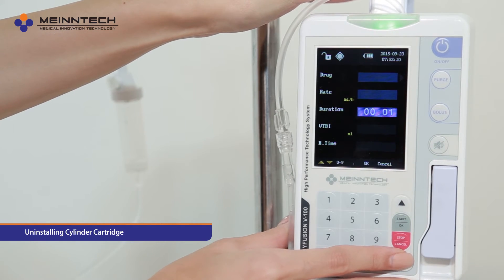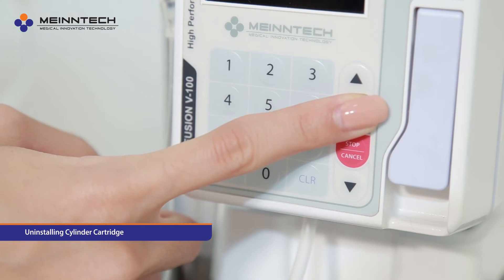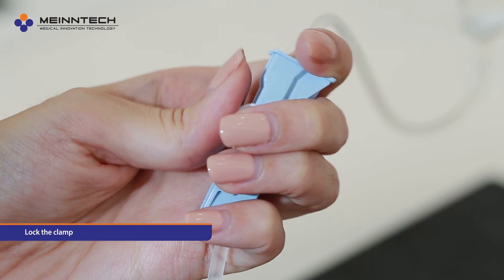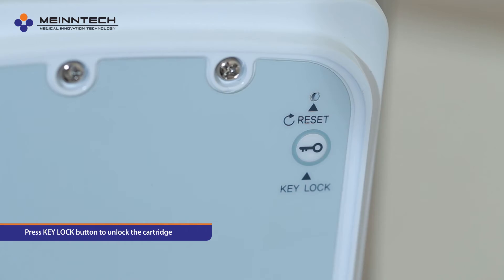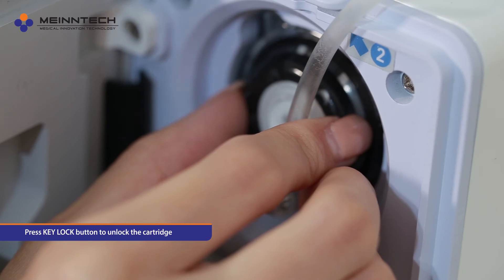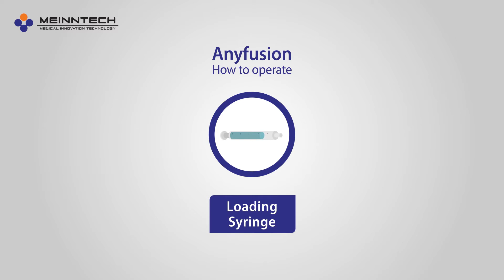Uninstalling the cylinder cartridge. When the alarm goes off after the infusion is completed, lock the clamp. Press the key lock button at the back of the pump machine to unlock the cartridge. Take out the cylinder cartridge.